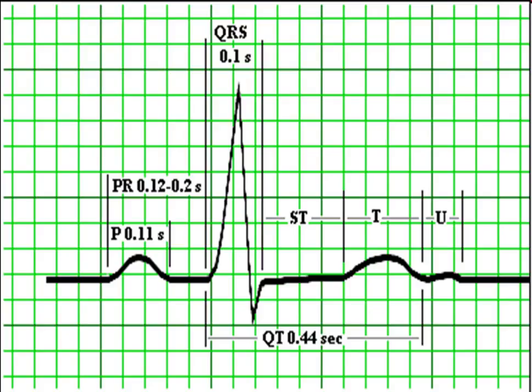This is an actual single beat. Now you can't really see it very well because of the particular dark lines here, but if I move my cursor up here, this is the beginning of that P wave. And this is a big dark box. So you can see that these intervals and distances can be measured using these little boxes. So the whole P wave itself is 0.11 of a second.